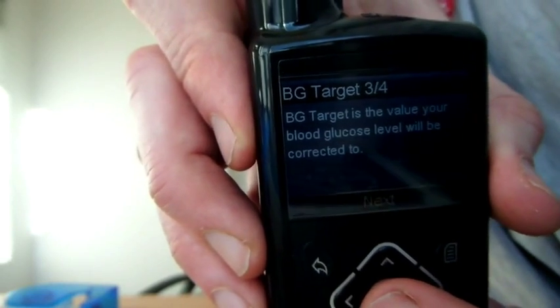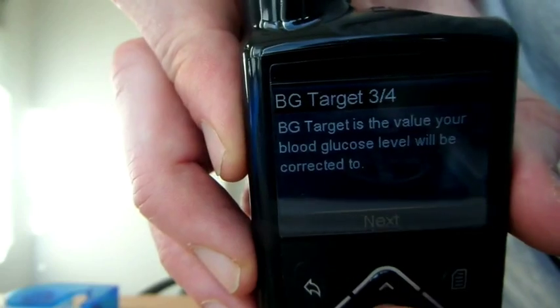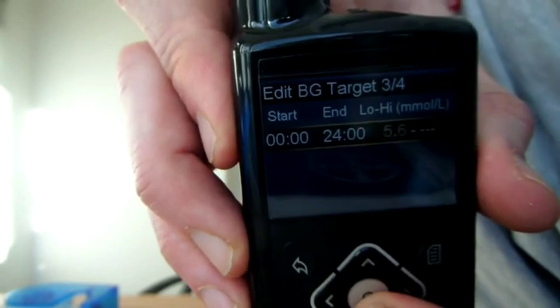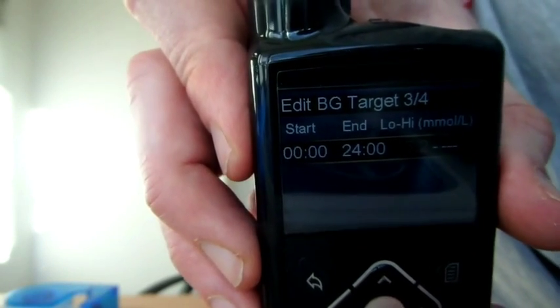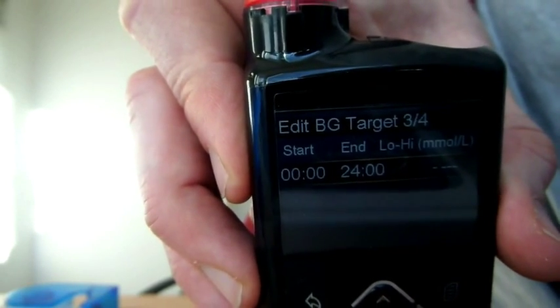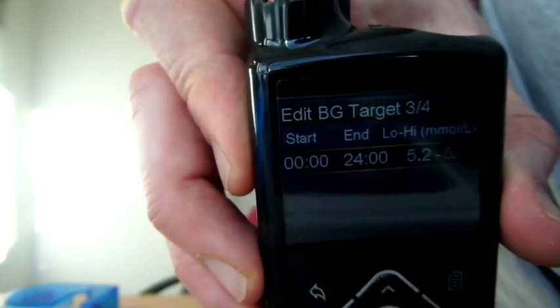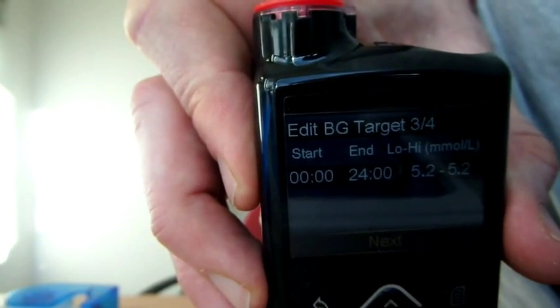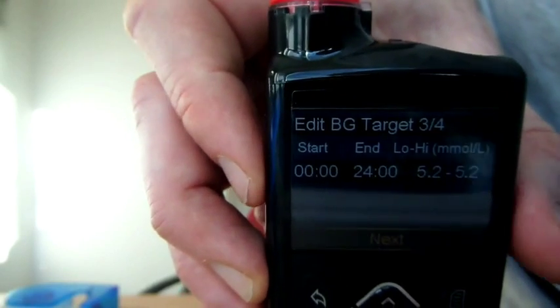BG targets — where do you want the bolus wizard to correct your blood glucose level to? For me, I want to set a single target rather than a range. Any blood glucose below 5.2, the pump will aim to take insulin off at mealtimes to bring it up to 5.2. At the same time, anything above 5.2, the pump gives extra insulin to bring it down to 5.2. So I'm aiming for the pump to get my glucose level to 5.2 at all times.